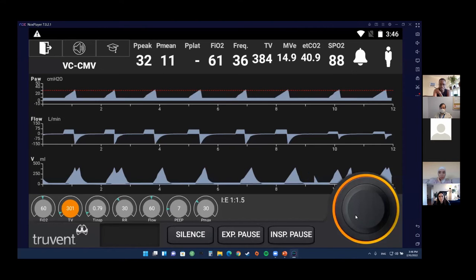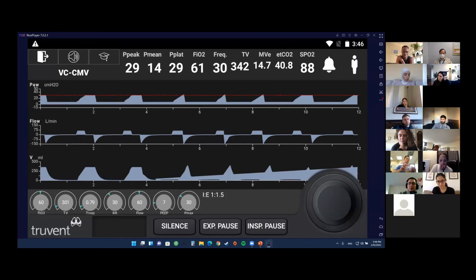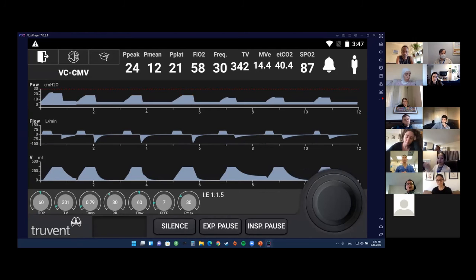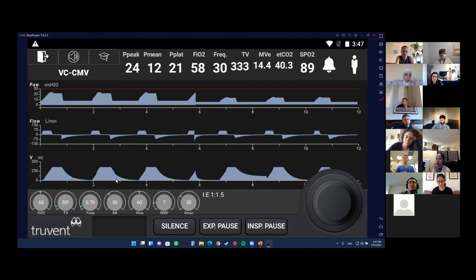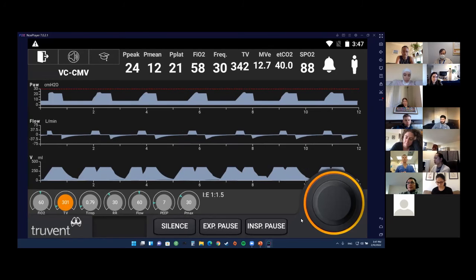Are you sure that that's the body weight we need to use? We need to use ideal body weight. How do we get the ideal body weight? From height and sex. Correct. So you can ask someone to get the ideal body weight, or you can use... said it's 80, so that comes to 320. And you want to do 320 because it's 6 times 80 or 4 times 80? 4 times. Okay, so you're going to do 4. Yeah, because it's ARDS, I'm going to choose to use low tidal volume.